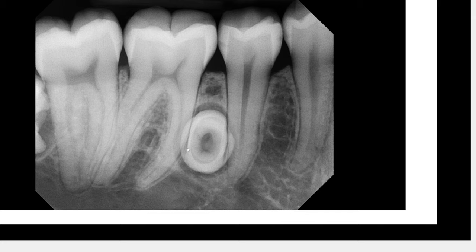Look at the overall density of this entity. We have a very densely radiopaque border, and internally it is very radiolucent. Those are important radiographic characteristics to consider as we work toward a diagnosis.